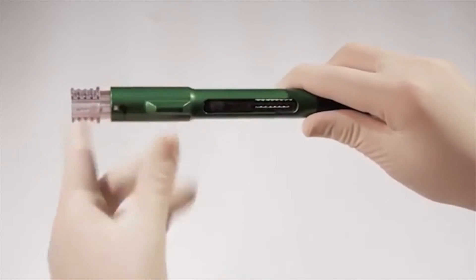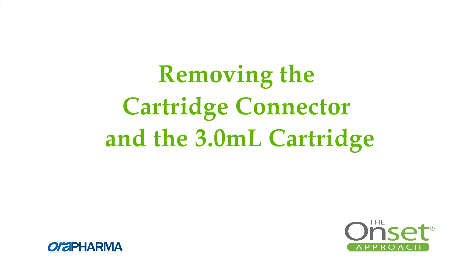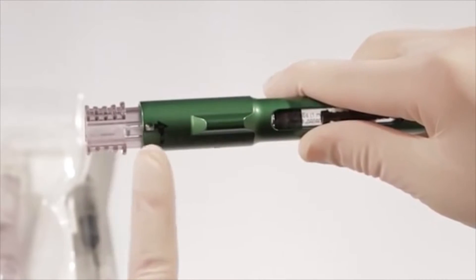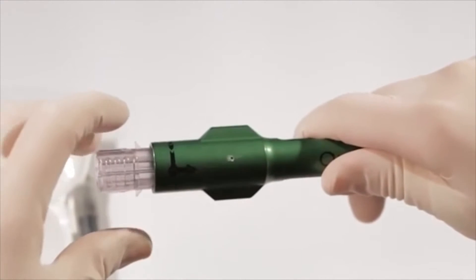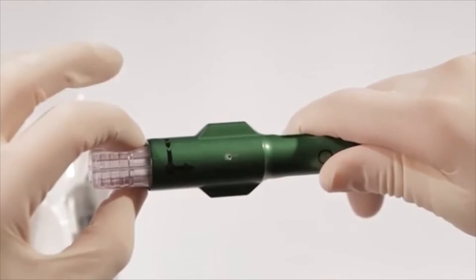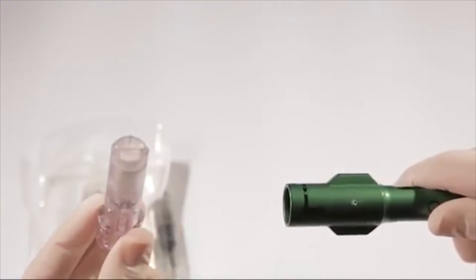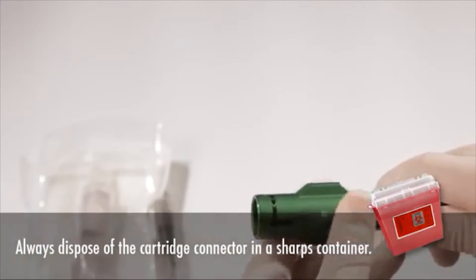Always replace the cartridge connector at the same time you replace the 3-milliliter cartridge. To remove the cartridge connector, make sure the arrow on the connector is aligned in the number one position on the pen. Push the pointed locking levers on the sides of the cartridge connector in with your thumb and forefinger, then pull the cartridge connector out of the pen. Use caution and carefully dispose of the cartridge connector in a sharps container.